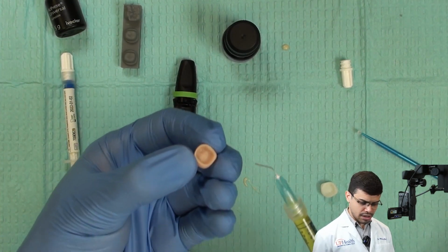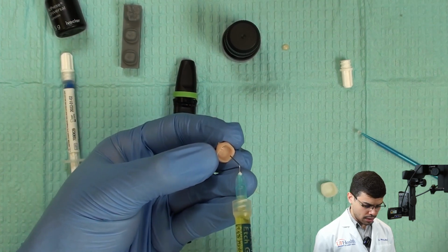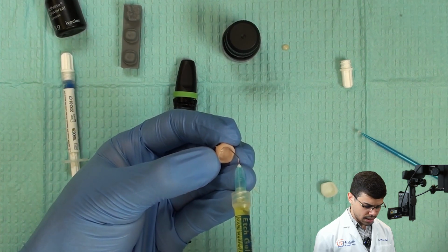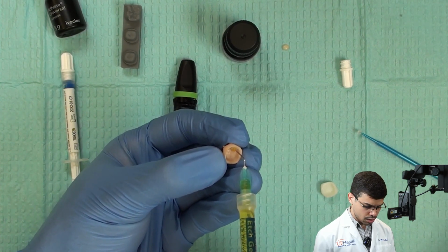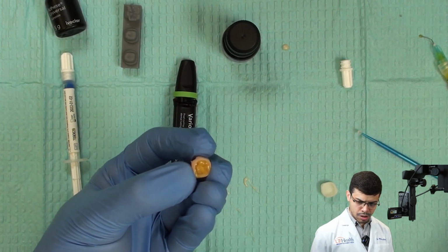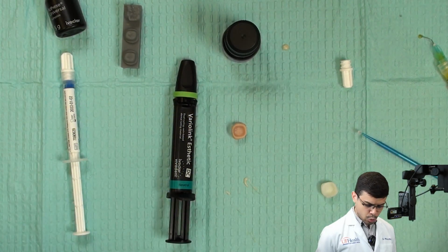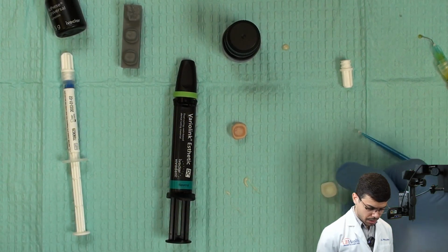So for this one is a lithium disilicate, so we have to etch for 20 seconds. So that's what I'm gonna do right now. I'm gonna etch the ceramic for 20 seconds. After that, I'm gonna rinse this one. So after rinsing and drying pretty well, I have this ready for the Monobond Plus, okay?